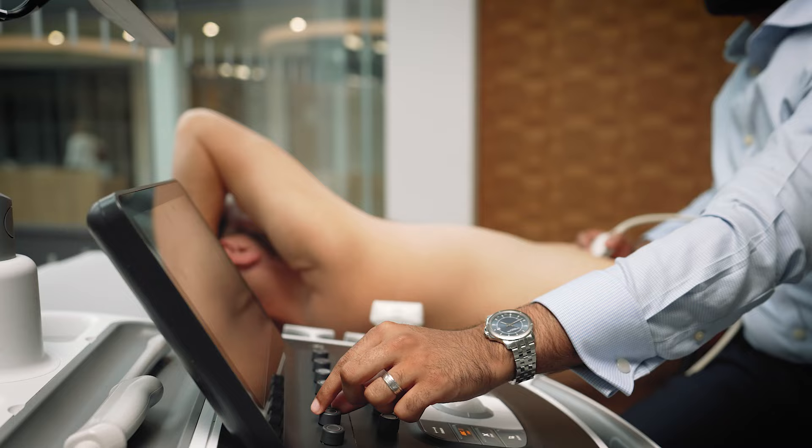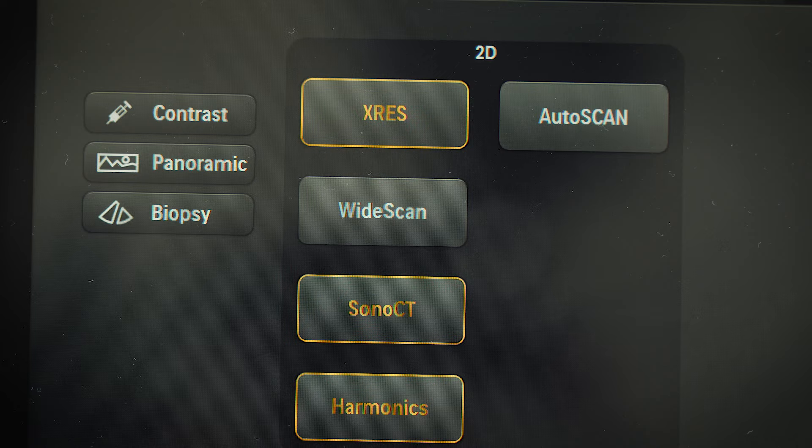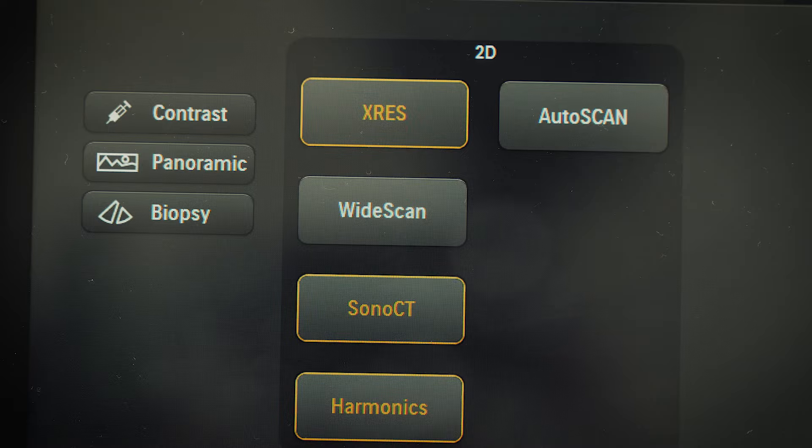Wide scan is available on all transducers except the EL18-4 and the ML26-8, where trapezoid imaging is available. They both widen the field of view and are available via a one-touch button located on the touch screen.